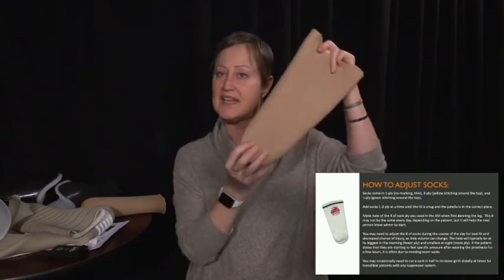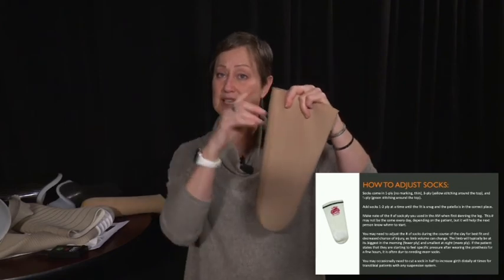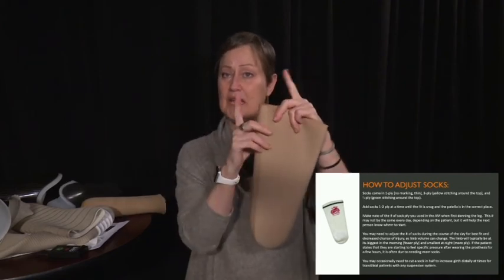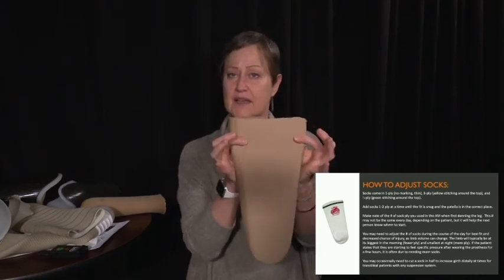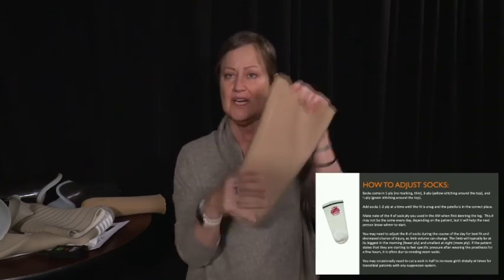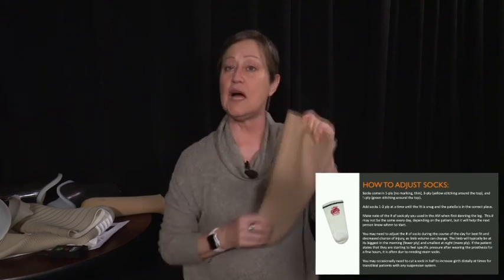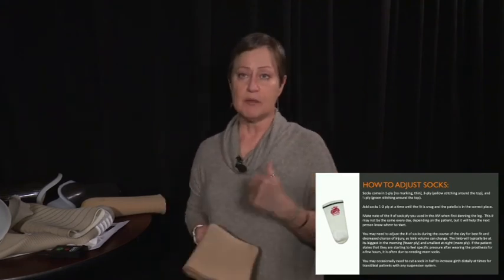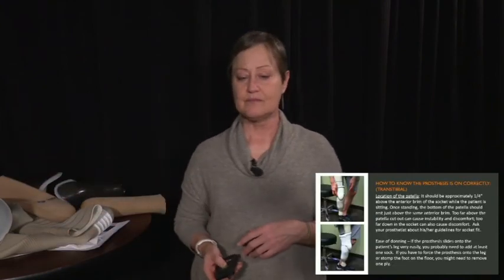If somebody has too much room distally, but they're fine proximally, especially at the knee, maybe where the socket is really snug against the lateral and medial aspect of the knee, but they're flopping around distally, you can cut a sock in half and fill up that space, and that often makes people a little bit more comfortable. So that's an extra little tip.